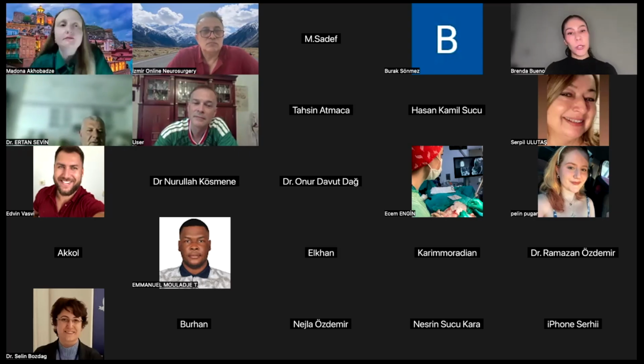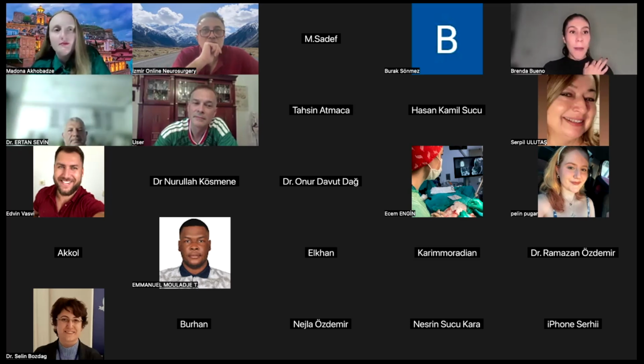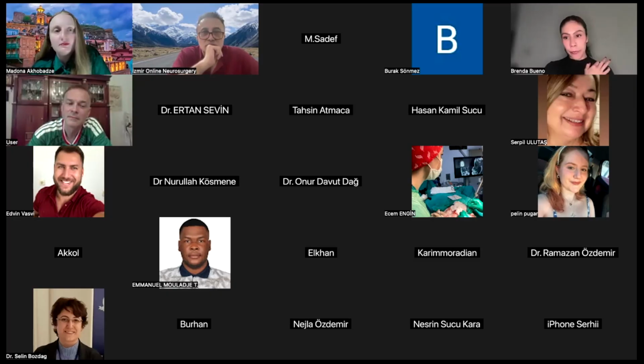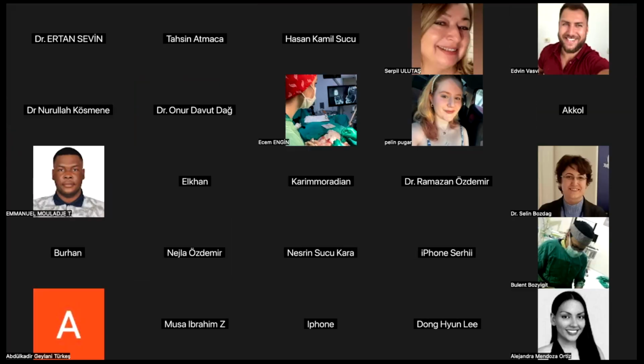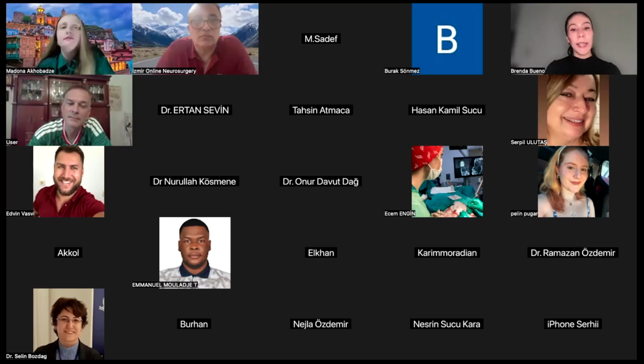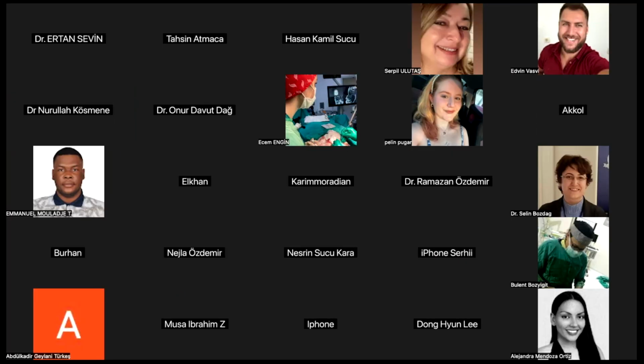Some implants with antibiotic are in studies, not public yet. If a patient with these implants has an infection, you do it with the endoscopic technique. You do a really exhaustive debridement and a really good irrigation with 4 or 5 liters with antibiotic.